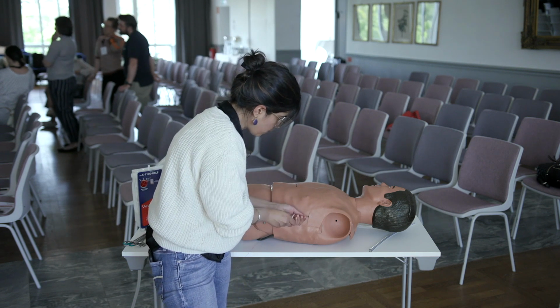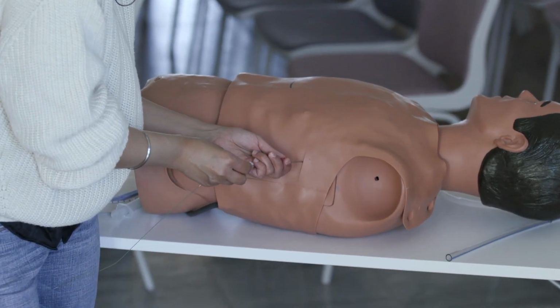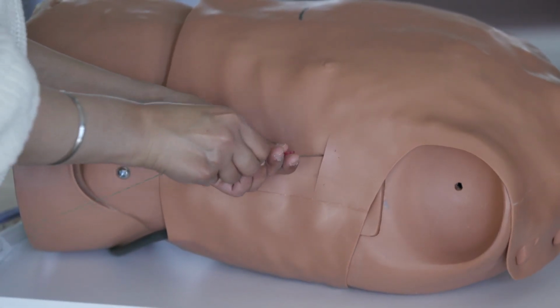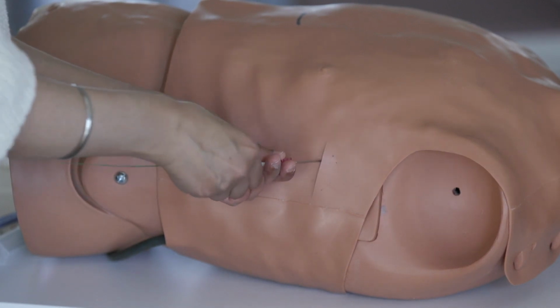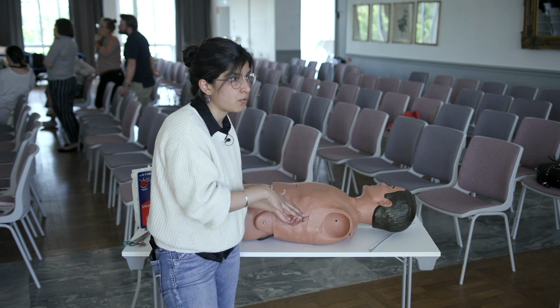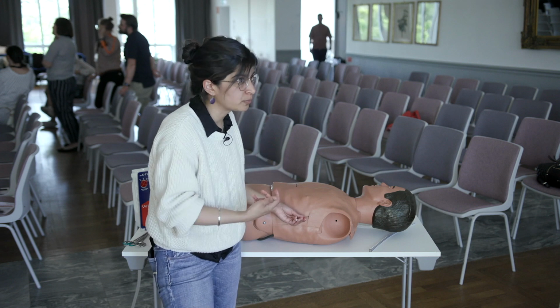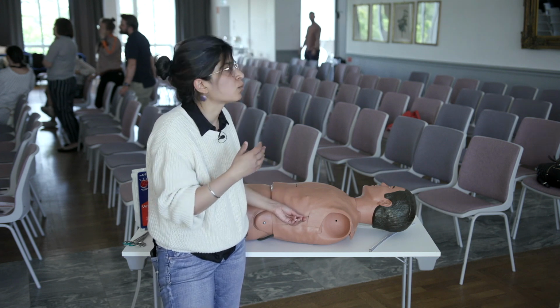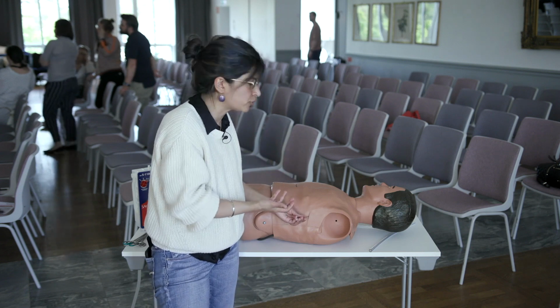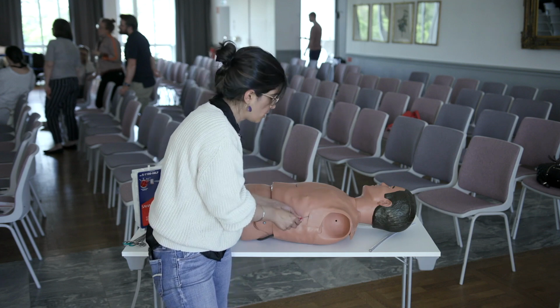So you take your wire. Come on. You have a little bit more hand-eye coordination than me, and you push the wire in. Most of the time your patient's awake when you're doing this, right? If you've ever done this before, when they feel the wire in their pleura, they cough. It's uncomfortable, and a lot of the time they will say something like, "Oh my gosh, something's wrong," right? Because they feel the discomfort. So just reassure them that everything's fine. This is just how it feels.